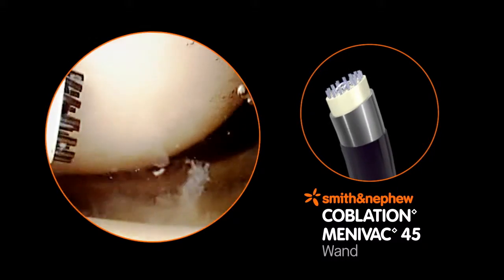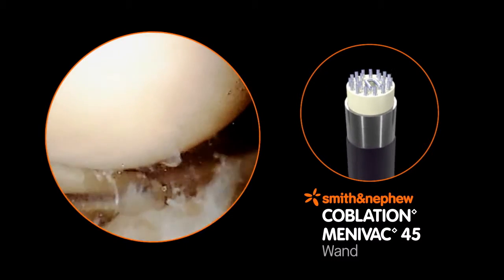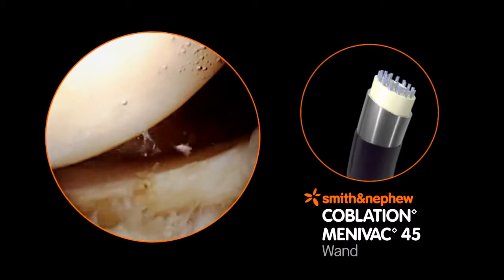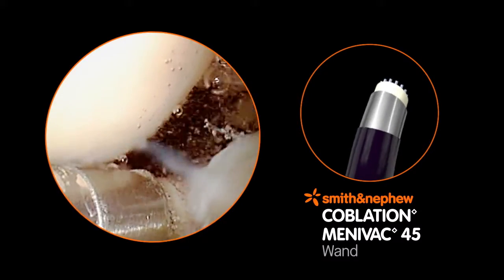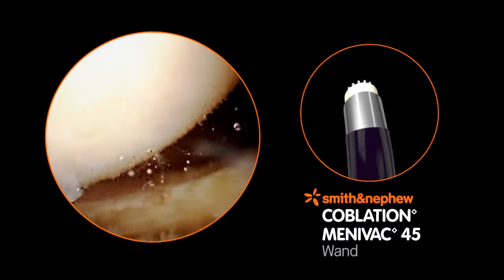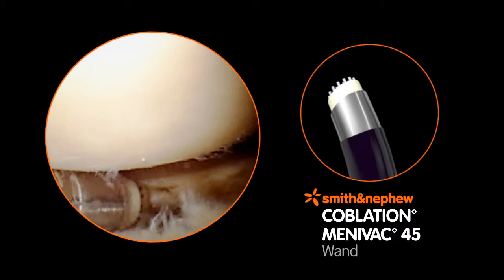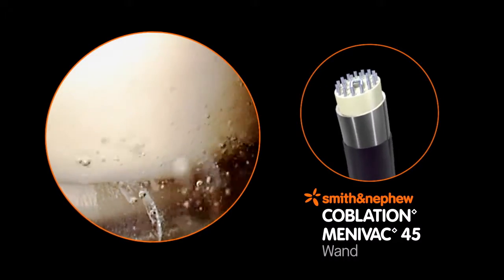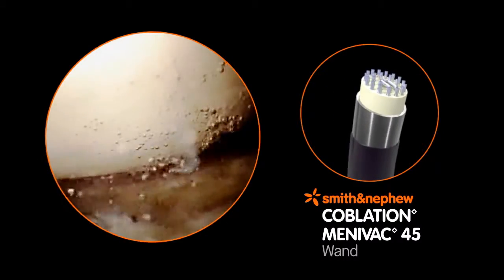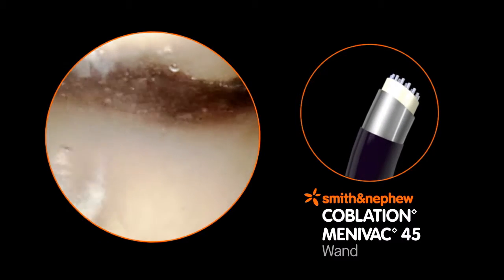The Menivac 45 Coblation Wand resects and ablates meniscal tissue while contouring tissue edges, minimizing the rough jagged appearance that may result from the use of mechanical instruments. The face and the side of the 15-degree beveled tip can ablate tissue, limiting the need to reposition the wand, and the slim shaft facilitates access and visualization during knee arthroscopy.